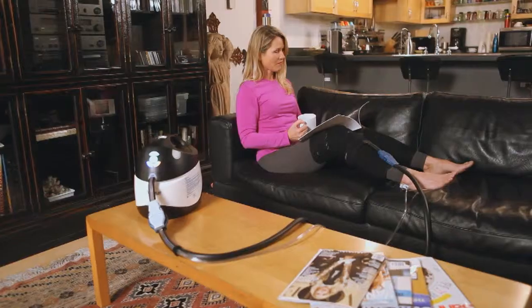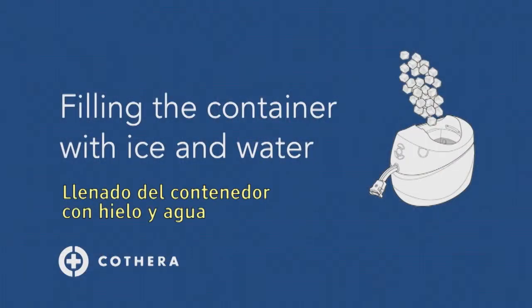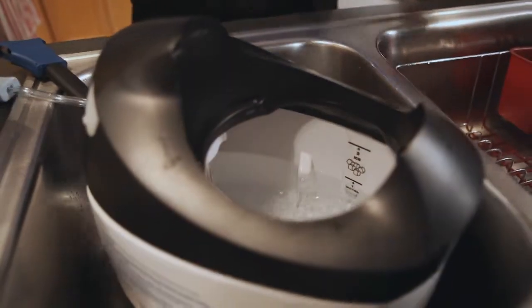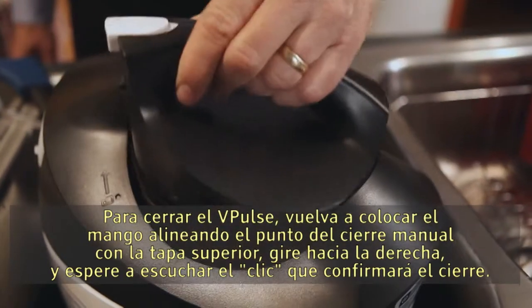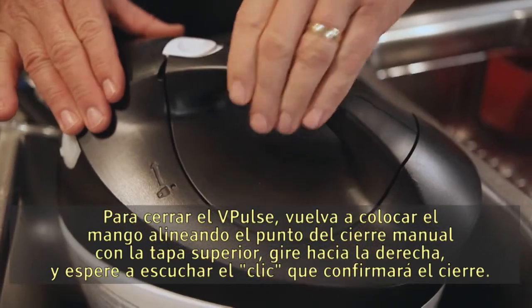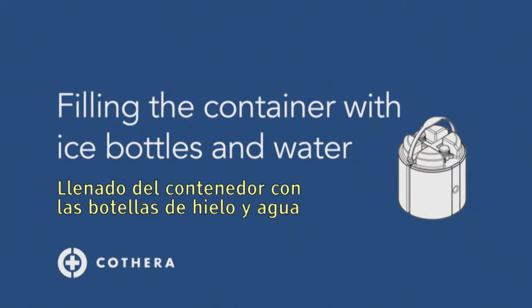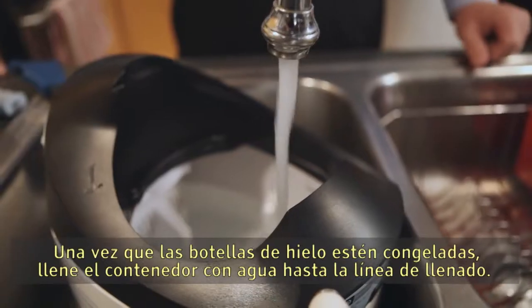Fill the container with water to the water fill line, then add the ice to the line inside the container. To close the V-Pulse, replace the handle, aligning the dot on the thumb lock to the top cover, then rotate clockwise, listening for the positive locking click.